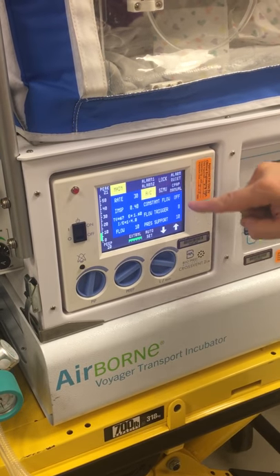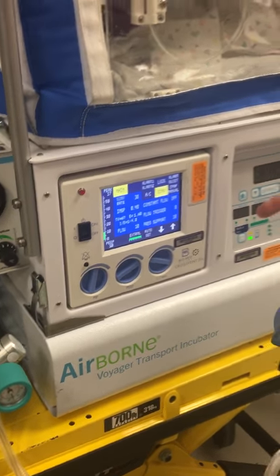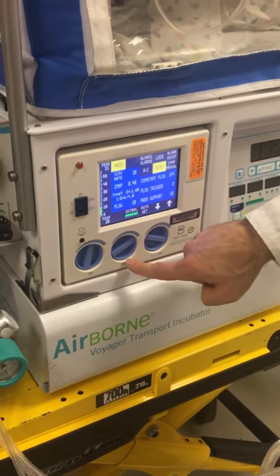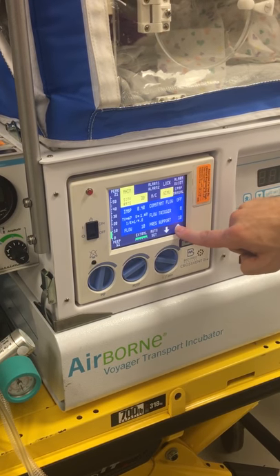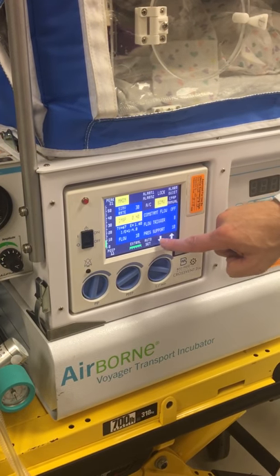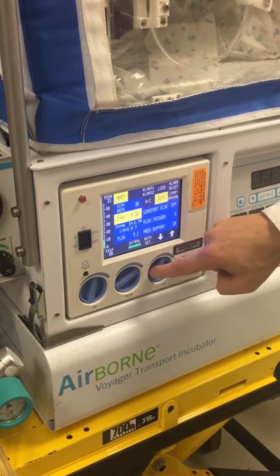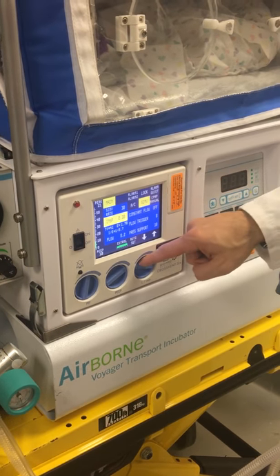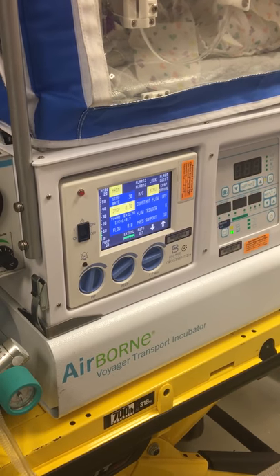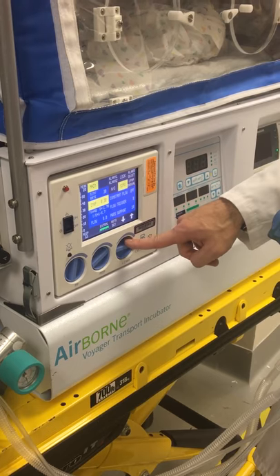Now you can see the mode is SIMV mode, AC mode, or CPAP manual — we won't use CPAP manual here. We're going to do SIMV mode for invasive ventilation — intubated or trached. You can set peak pressure, PEEP, flow, and SIMV rate using touch and arrows. If we want a rate of 30 we up and down it to 30. For an I-time of 0.3 we press it and use the arrows. Eight liters of flow is a decent starting position; if the baby's retracting we can give them more, up to 10 if needed.